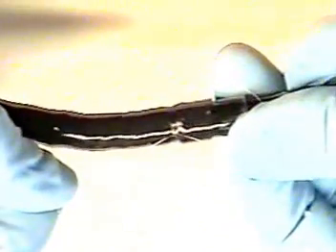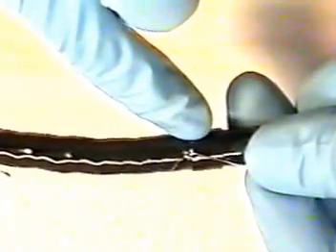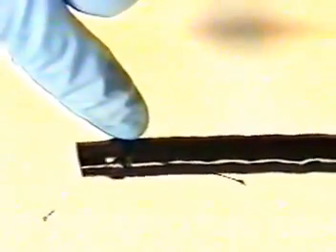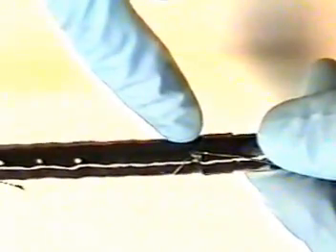Now your binding is tight with your turns and should be airtight, as not to allow any air to escape from the glue job bending joint. We now have 2 bindings, one at the distal end, right up against the distal end hood or C-cover, and the second where the insertion tube meets the bending section. Again, cut off the excess thread, at least 1 inch.